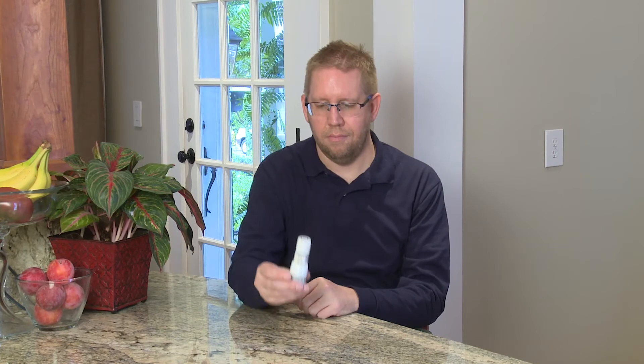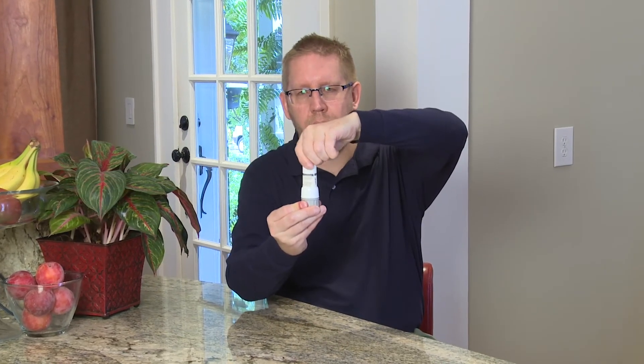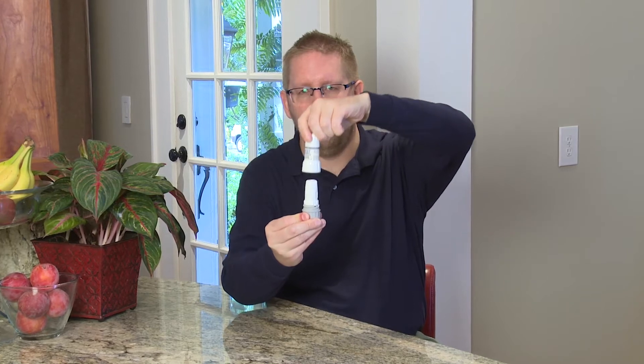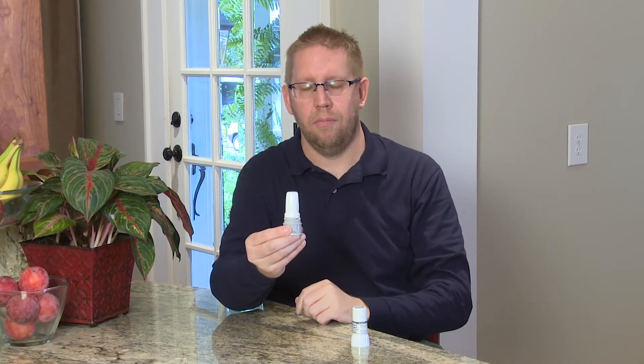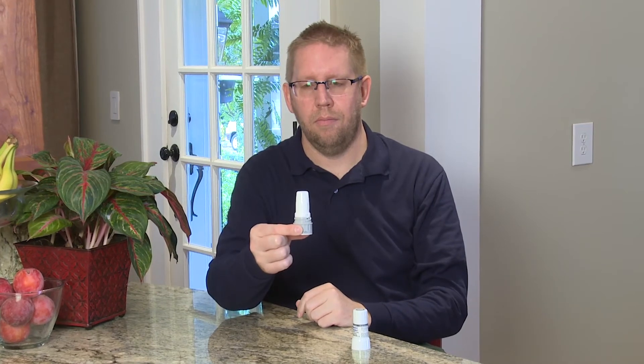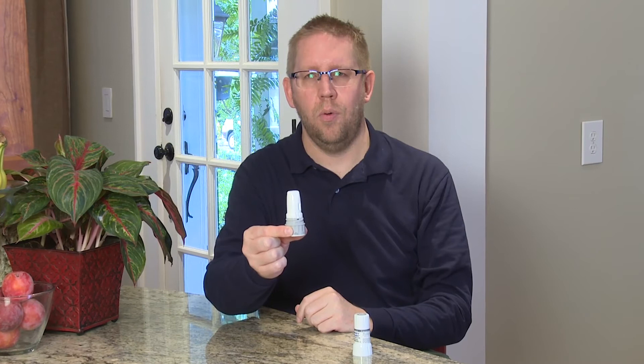Many people have trouble breathing and need to take medicine to help them breathe better. Medicine for your lungs can be taken many ways. One way is by using a twist haler dry powder inhaler, sometimes called a twist haler. It lets you take medicine in powder form — you have to breathe in the dry powder medicine using the twist haler.